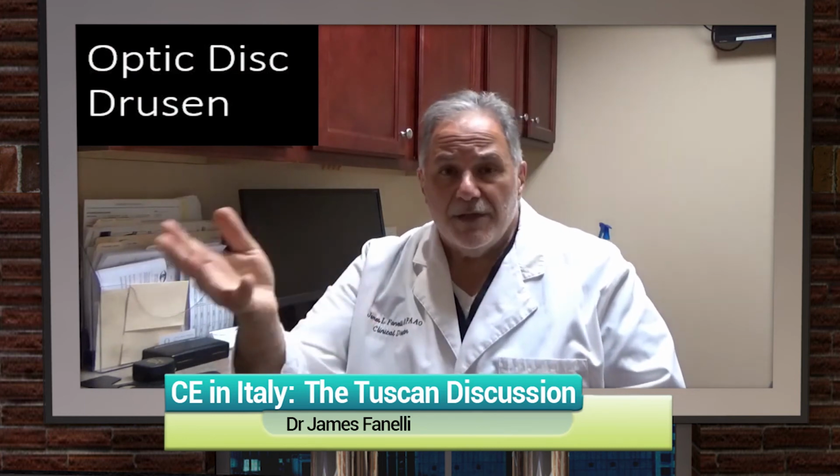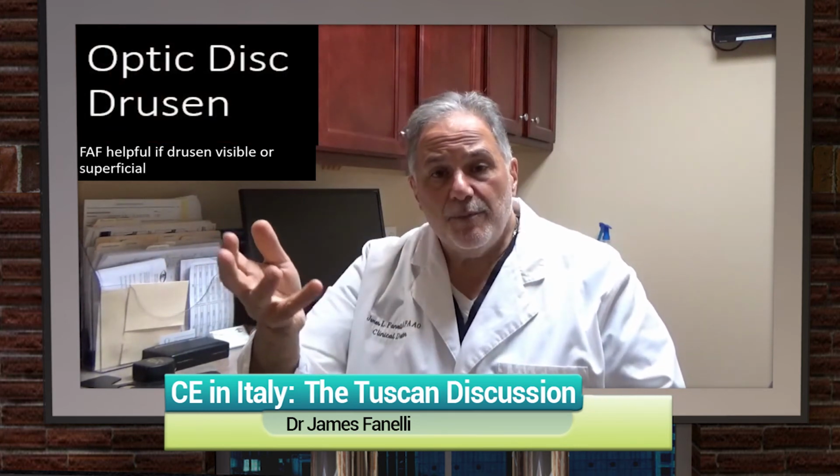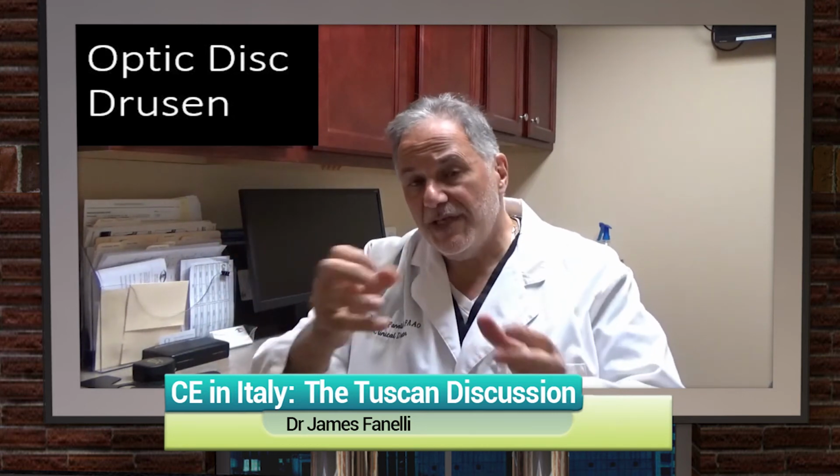Remember, if we have optic disc drusen or we suspect optic disc drusen, shoot a fundus autofluorescence. See if anything lights up, because disc drusen will light up under fundus autofluorescence. If you have access to a B-scan, that can also help to see and isolate optic disc drusen. You're going to see an elevated disc with a B-scan if you're looking at papilledema, but you're looking for those hyperreflective areas in optic disc drusen. In pediatric cases where there is suspected optic disc drusen, fluorescein angiography can play a role in differentiating these conditions.